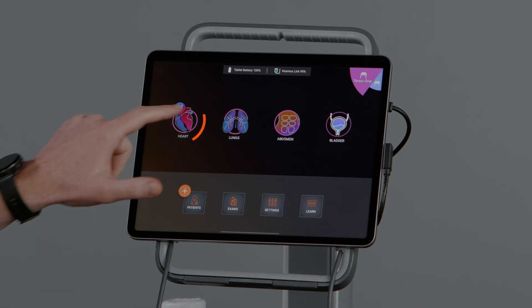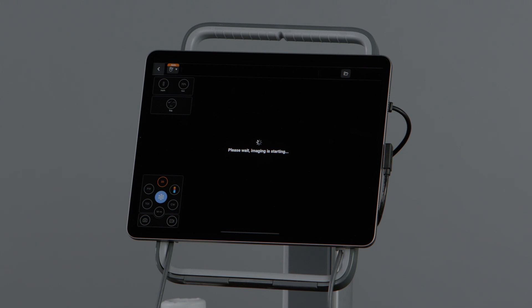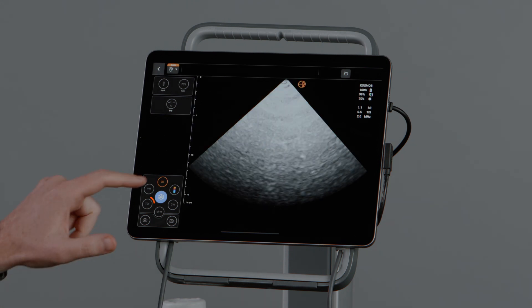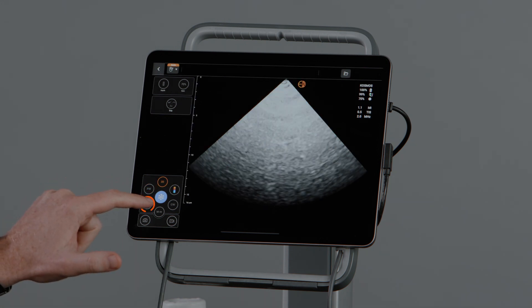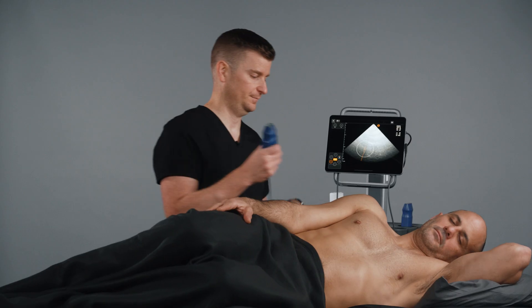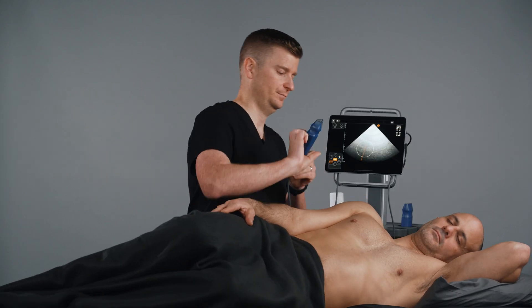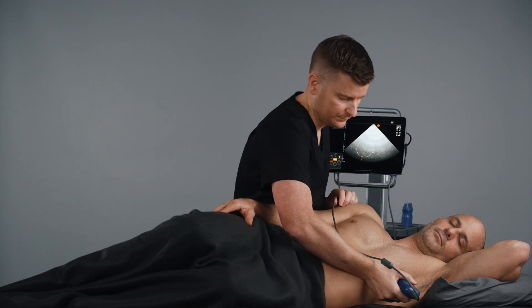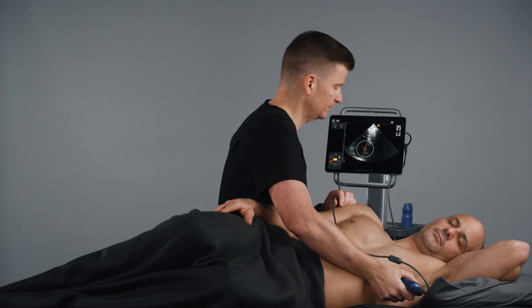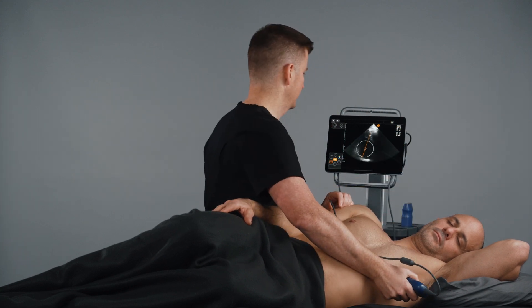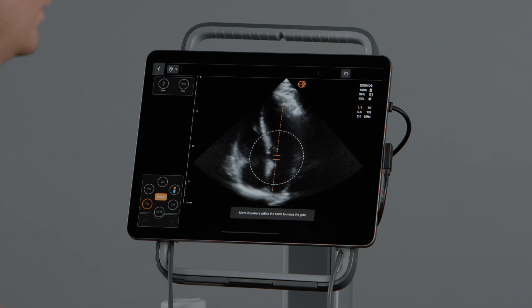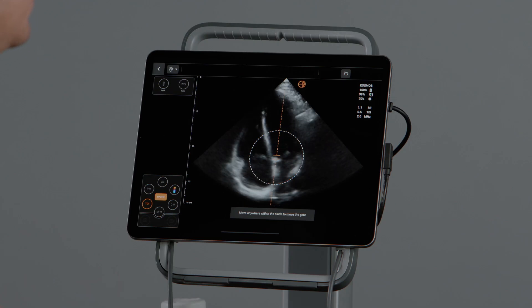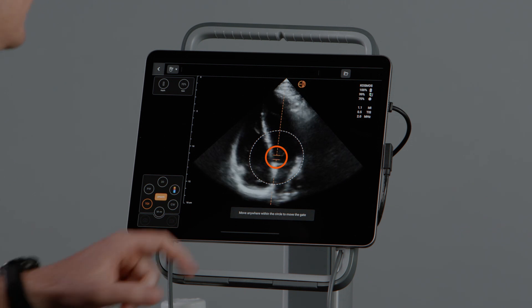First, select the cardiac preset, then tap the TDI icon. Place your sample gate at the desired myocardial location, in this case the septal mitral annulus. To move the sample gate, simply hold and slide.